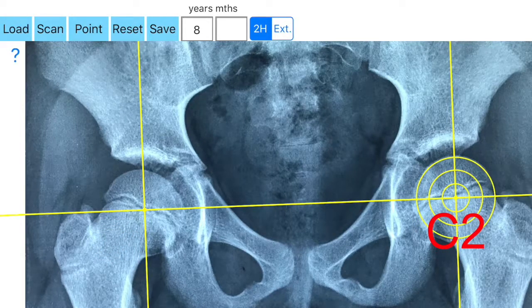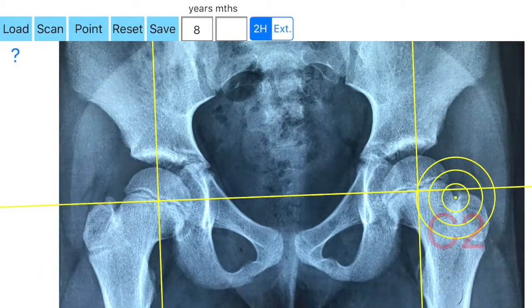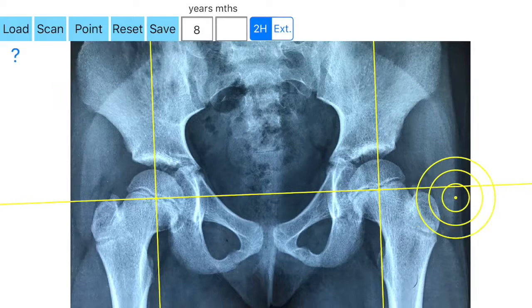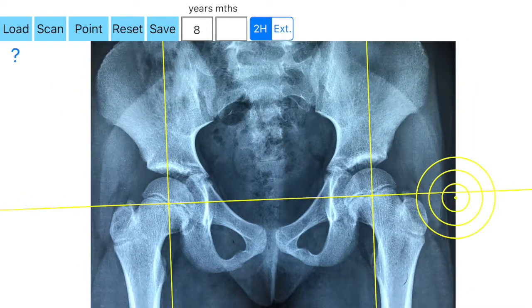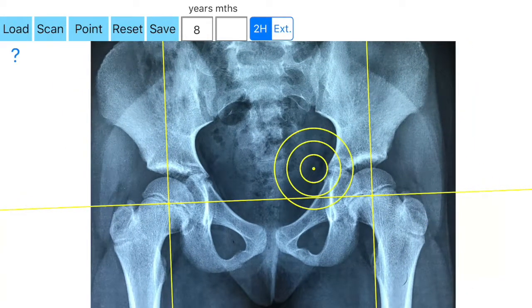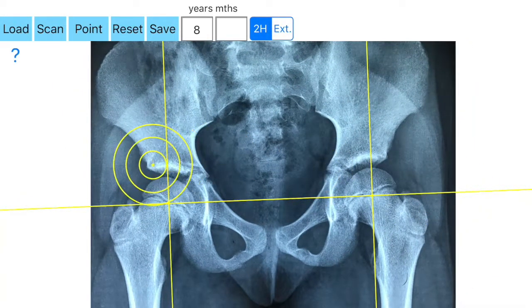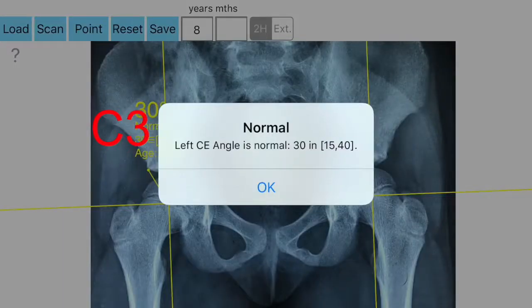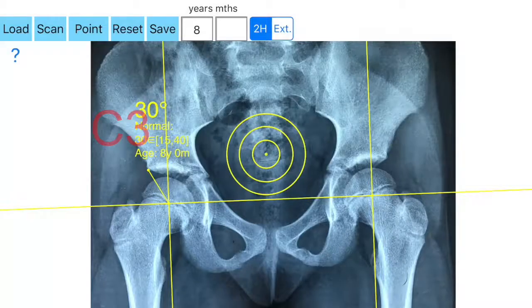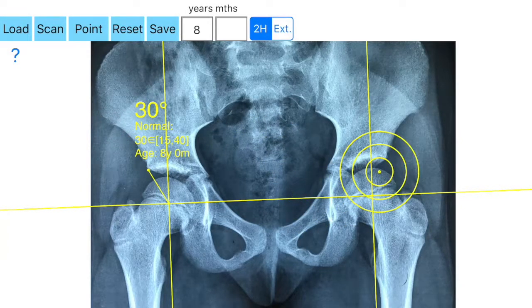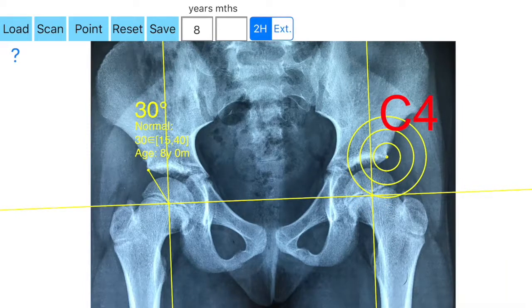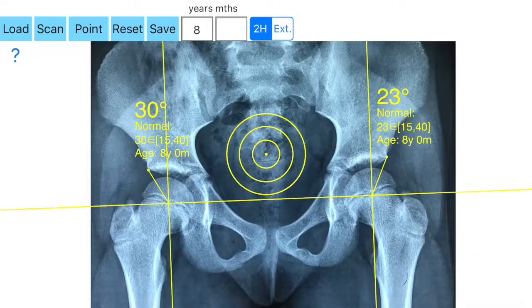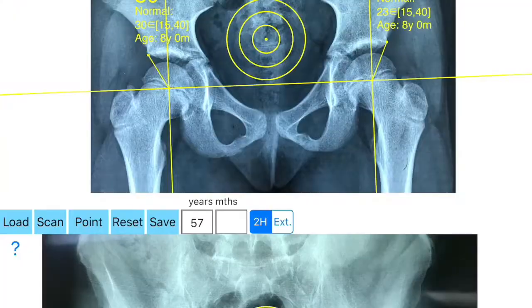After that, a horizontal line appears. You are ready to mark first the right lateral acetabular border — the third point, C3 right. The right C angle is printed on the screen with the relevant categorization near the right hip. In the same manner, mark the left lateral acetabular border, C4 left, and the results are printed on the screen.